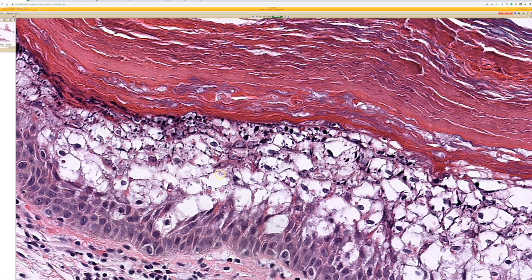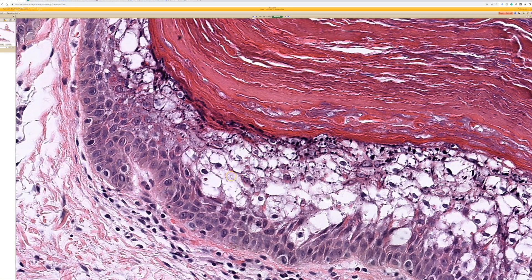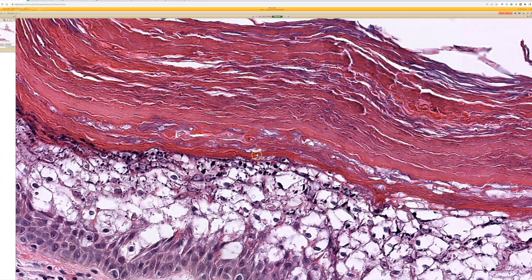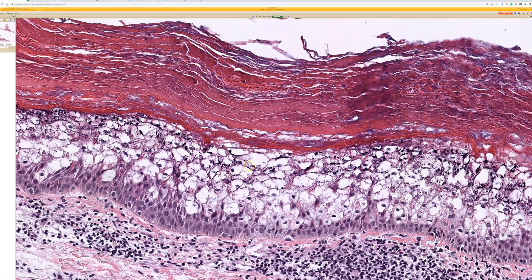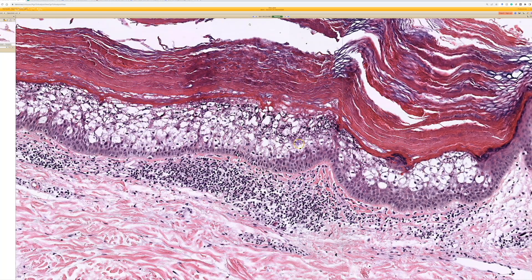This is a really nice characteristic example, but it can have a variety of different textures and mixtures of those findings. Often there is overlying hyperkeratosis with both orthokeratosis and parakeratosis scattered in there.